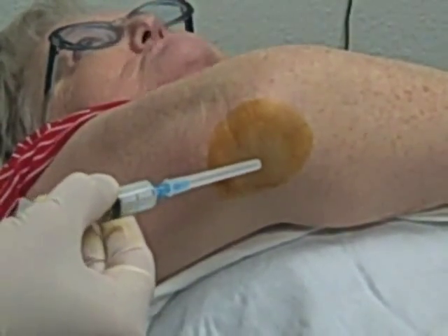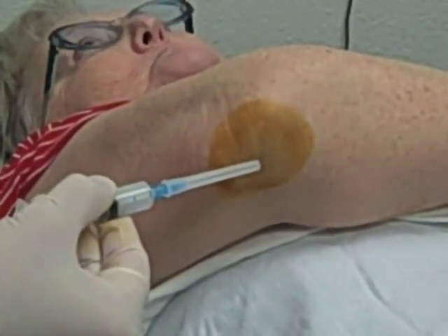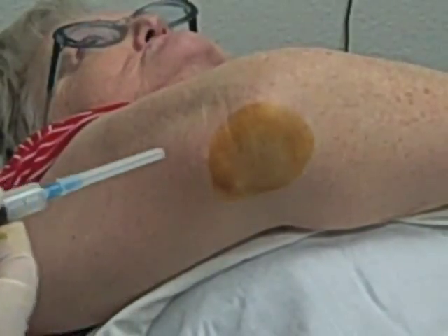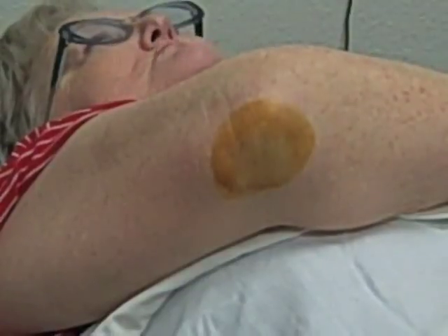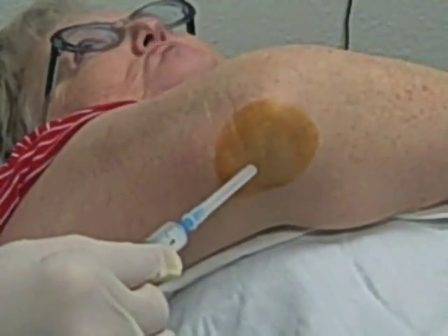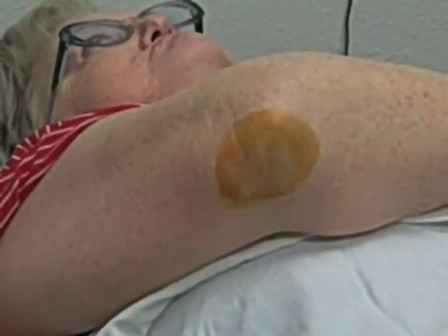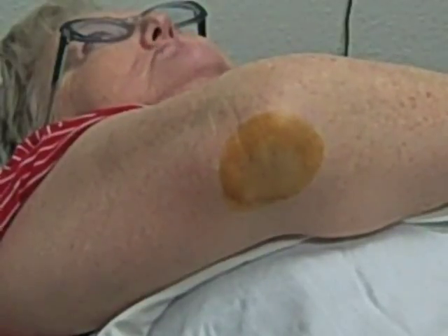We've identified the key landmarks, which are the medial epicondyle, the ulnar groove, and the ulnar nerve. The injection site has been marked — it's the point of maximal tenderness — with the ulnar groove and the ulnar nerve running in the groove.